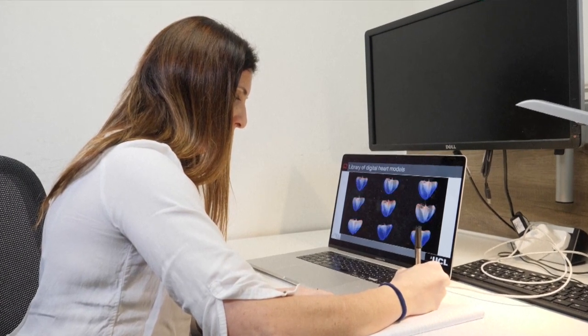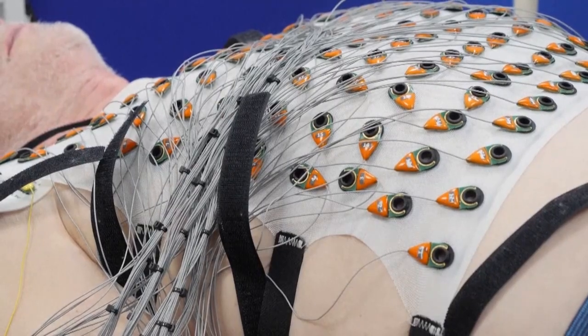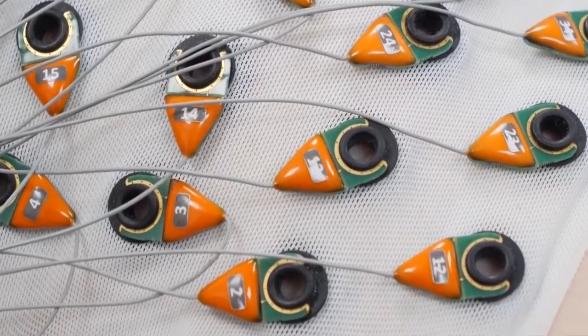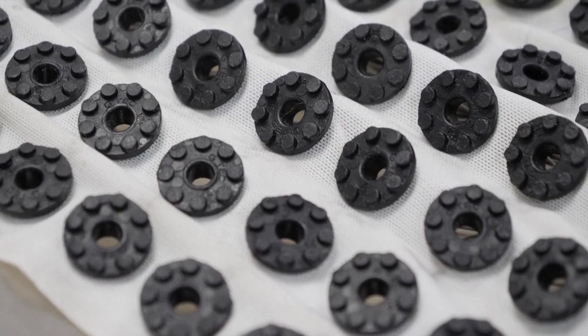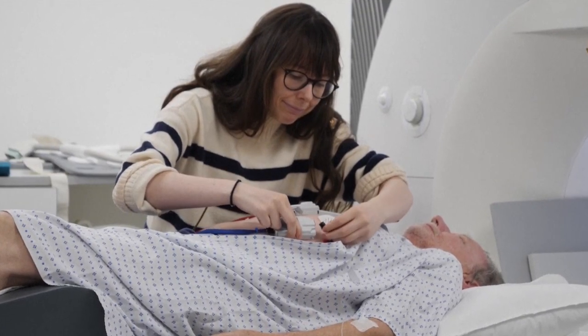While it's currently being used to map people with a few specific heart muscle diseases, it's also believed this new ECGI vest will help identify patients who need an ICD, or implantable cardioverter defibrillator, a device that monitors the heart's rhythm and shocks the heart back to a normal rhythm if necessary. ICDs can save lives, but they carry a risk of infection and can cause distress if they give out unnecessary shocks.